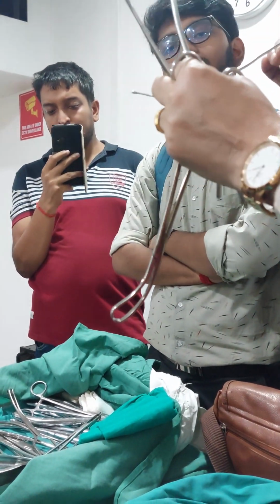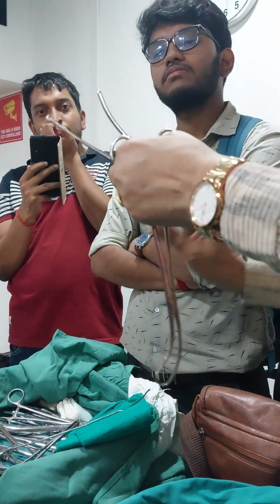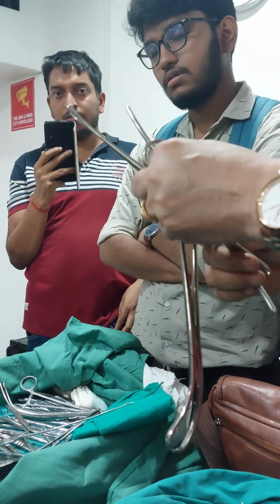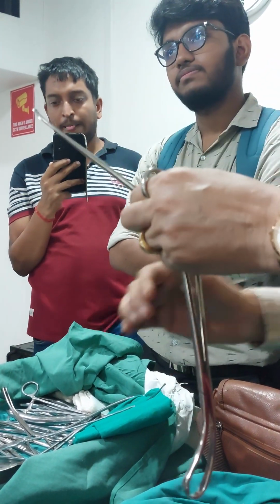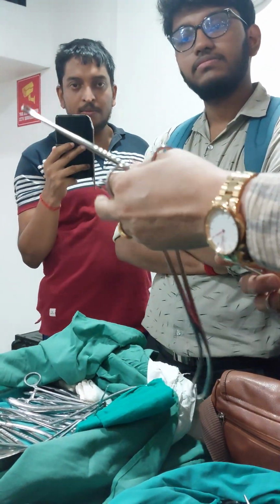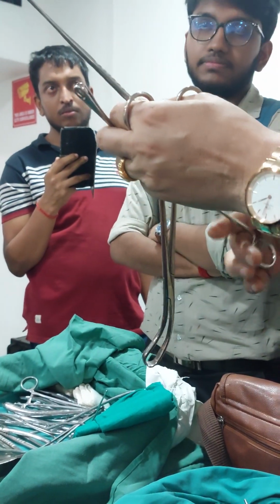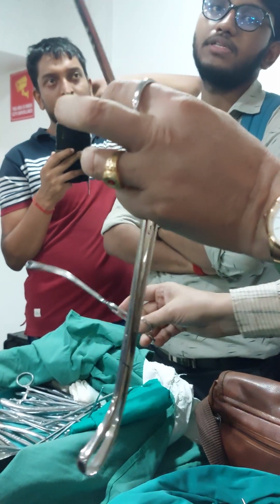So first you introduce the sound so that the canal is partly dilated. Next, all these instruments you have to introduce serially, starting with the smaller one, then go to the larger one. The aim is to introduce the later instruments like this ovum forceps. If you try to introduce the ovum forceps in a narrow canal, you cannot do anything. The canal has to be dilated, then only you can introduce all these instruments and do the rest of the procedure.